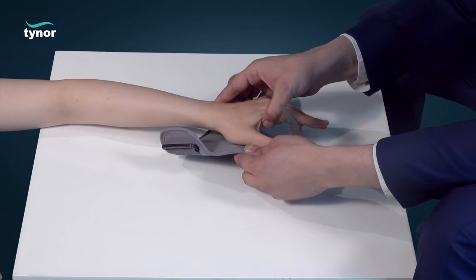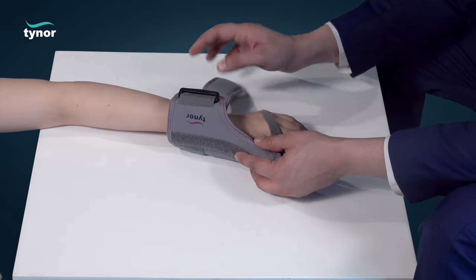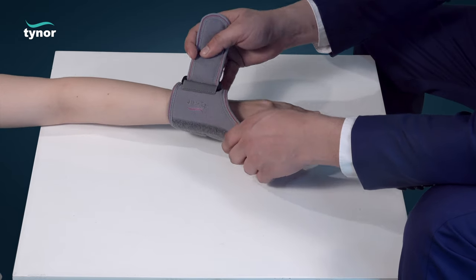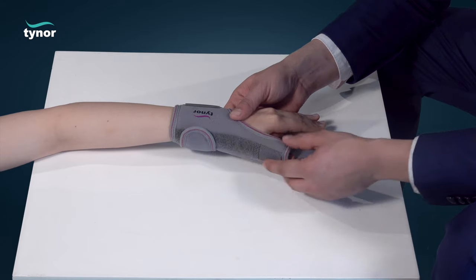Wrap the wrist band of the thumb spica around the wrist. Fasten the hook loop fasteners to a comfortable compression with reverse buckle mechanism.